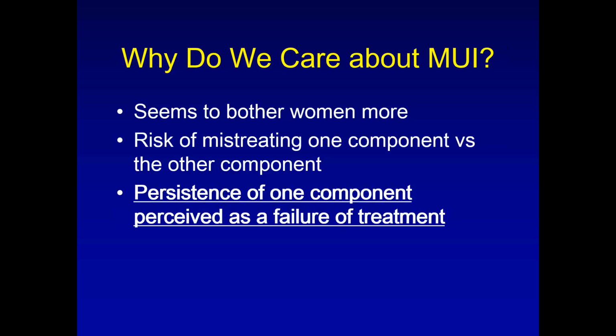However, if I had a patient with incontinence, had a urodynamic study, and they're there for stress incontinence, but I see overactivity too, that's one where I may tell them, look, I'm seeing two problems. We'll treat the one that bugs you, but the other one may still be there later, and you may need to treat it. So it really does help for counseling. If nothing else, it enables you to document it ahead of time that they might have this problem. You warn them ahead of time and they have it, you actually look smart, and that's always a good thing.